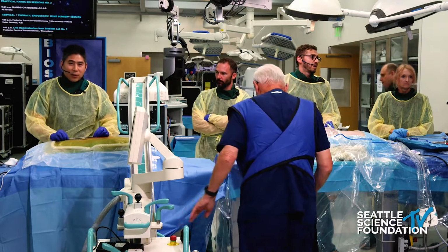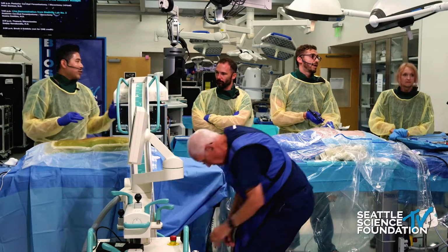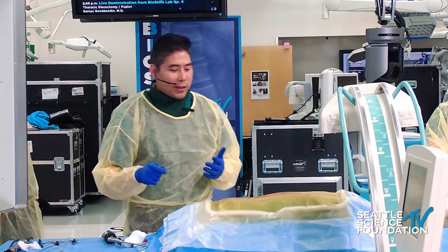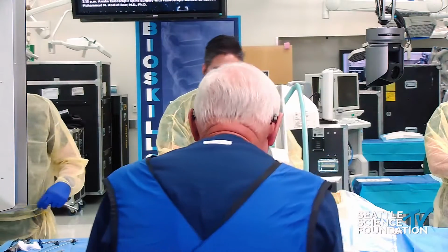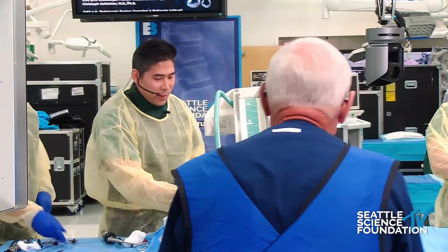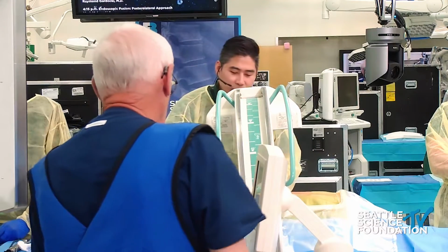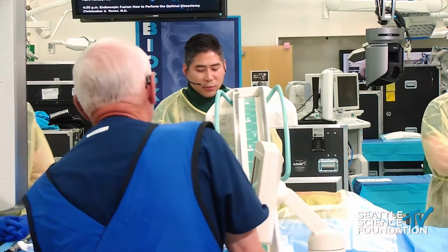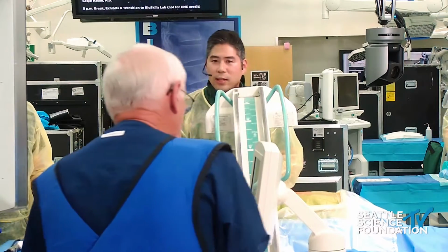For interlaminar, Osama did a beautiful job, and that's a lot harder. I think the transforaminal approach is, in my opinion, a very challenging approach to first learn. The interlaminar approach is sort of a workhorse of the endoscope. You come down the midline, the anatomy is very similar. It's not as much fluoro shot to localize, so you can take a shot right here.